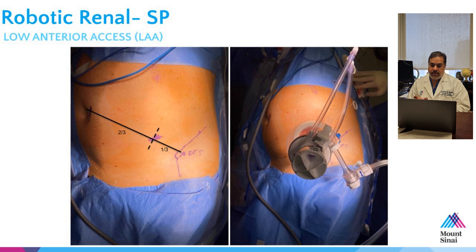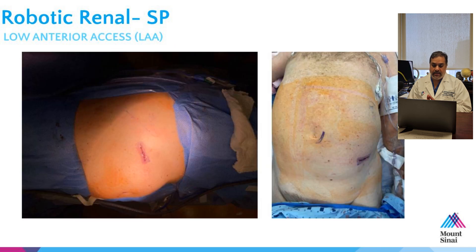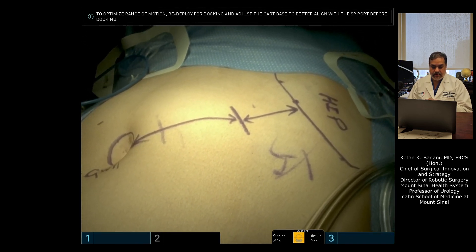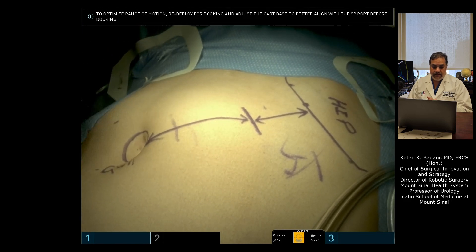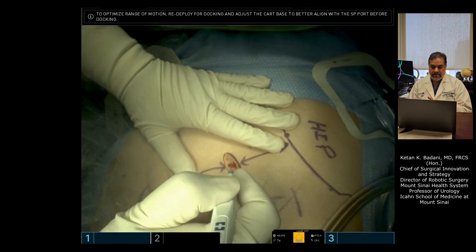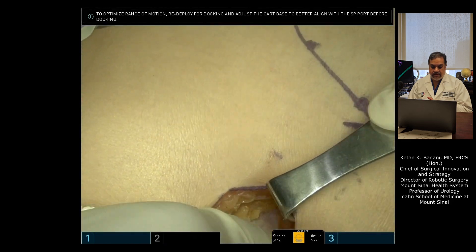This is an incision that is approximately three centimeters, made between the anterior superior iliac spine and the umbilicus, about one third away from the anterior superior iliac spine, as you can see here. The patient is supine with a little bit of a bump and we're about one third laterally. That's where the incision is in the supine position. I'll make my three, maybe three and a half centimeter incision and go through the subcutaneous tissues including Scarpa's fascia.